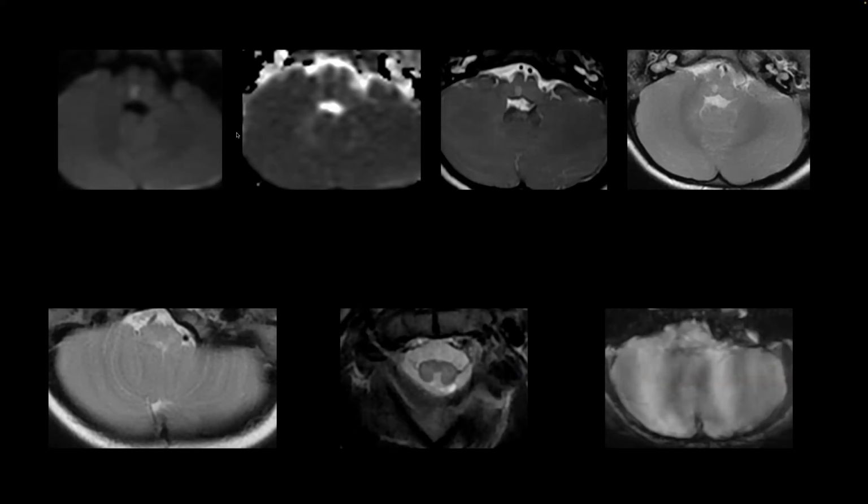Supratentorially, the structures were normal. There is a focus in the lower medulla along the paramedian aspect on the right side demonstrating restricted diffusion. On the T2 weighted sequence, you can appreciate the focal T2 hyperintensity there. Coming down inferiorly, the medulla is also slightly T2 hyperintense. There is a partial clefting along the dorsal aspect of the medulla, but the structures are hyperintense. There is some degree of edema. No mineralization or hemorrhage on the SWI sequences.